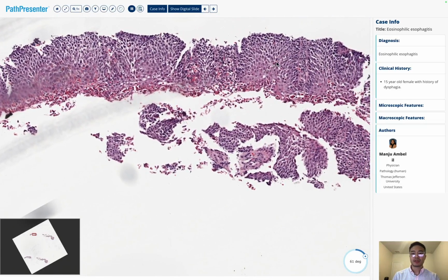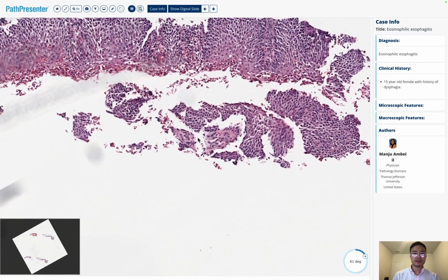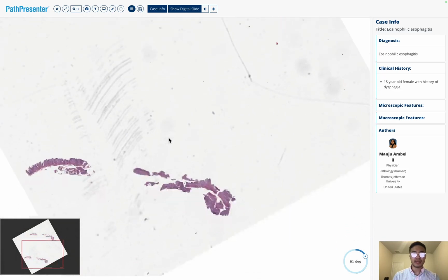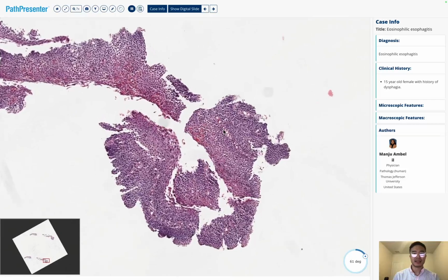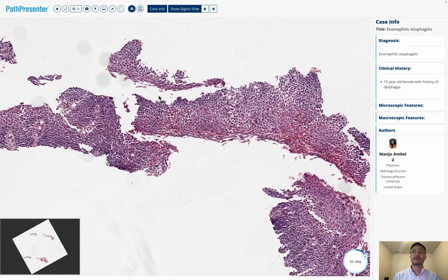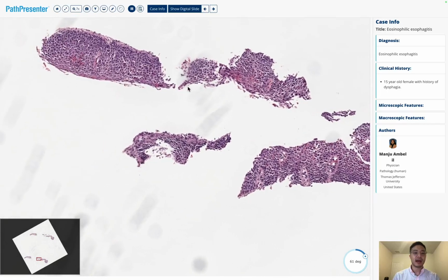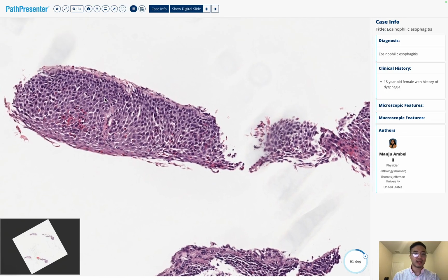So in addition to spongiosis, we see eosinophilic microabscesses. Oftentimes you'll see lamina propria fibrosis, and clinically that's indicated by the tugging sign, where the endoscopist really has to tug at it and it can cause bleeding. You can also see some trachealization or felinization, where the esophagus looks like the trachea of a cat.